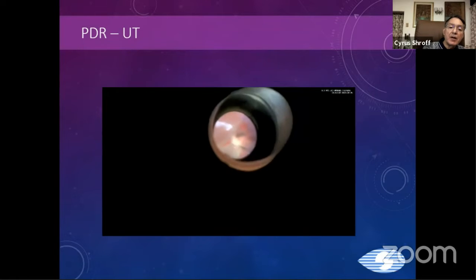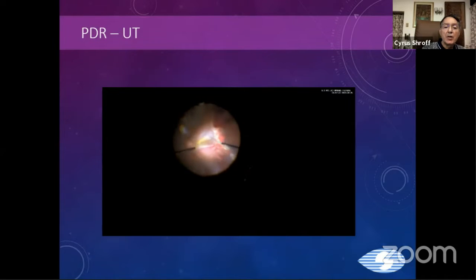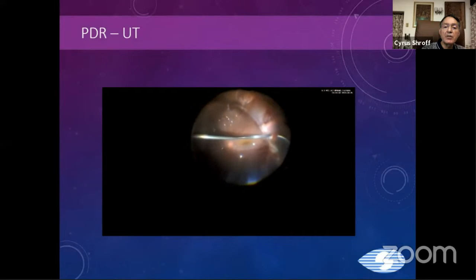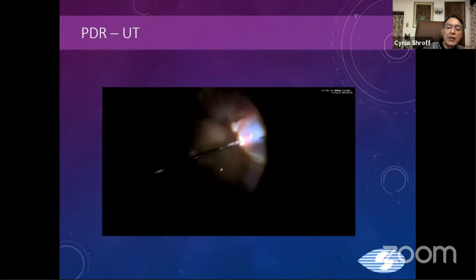And after that, we still found the retina in the temporal side looking stiff, and we found there was some subretinal hemorrhage. Now, subretinal hemorrhage we do encounter in diabetics, but usually it's mild. But since the retina was stiff, we now put in a PFCL bubble to protect the macula and then decided to remove that subretinal hemorrhage. And to our surprise, there was this huge clot.